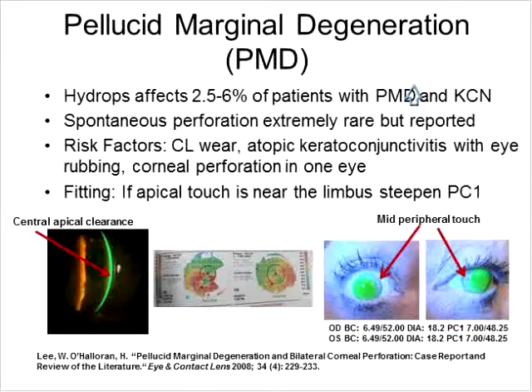And at this time, I don't feel like I need to use the Visante very much, but they make such really good photographs, and it's in the room right next to mine. I still use it quite a bit. We have the Visante also.